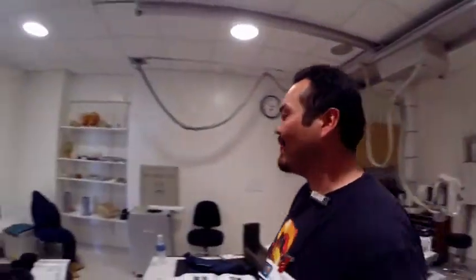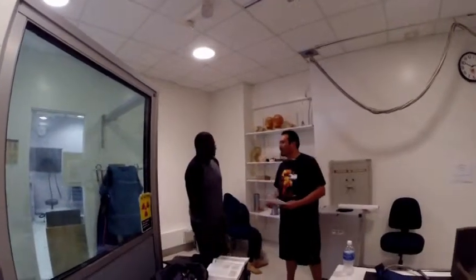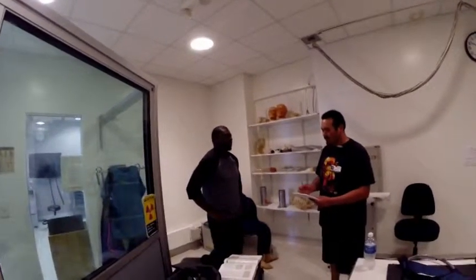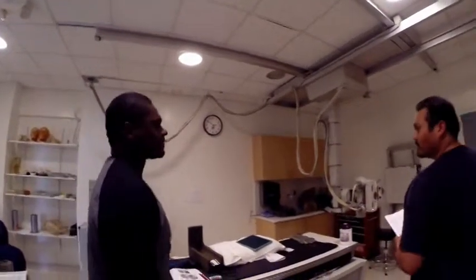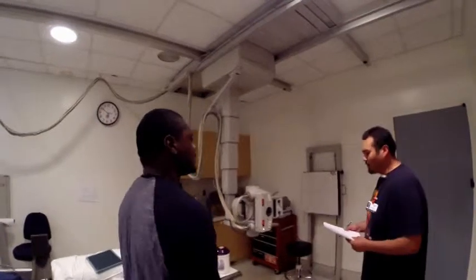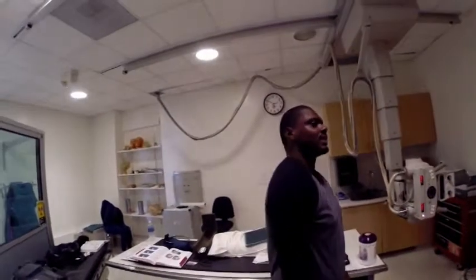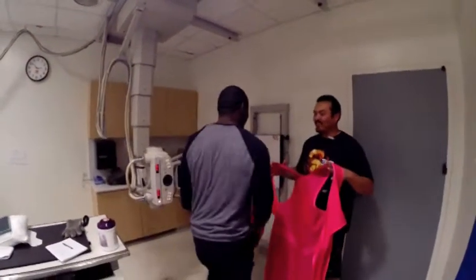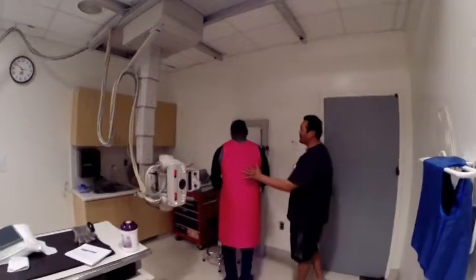Alright, let's go ahead and grab our patient. John Hutchinson, how are you doing? Nice to meet you, my name is Alfredo, I'll be doing your procedure today. Can I get your date of birth? 4/6/88 — alright, that's you. We're going to be doing sinus x-rays on you today. What's the reason? Sinus problems. Since Mr. Hutchinson is male we still go ahead and ask: is there any chance of pregnancy? No. We're going to shield our patient from the back since our primary beam is coming in from the back.